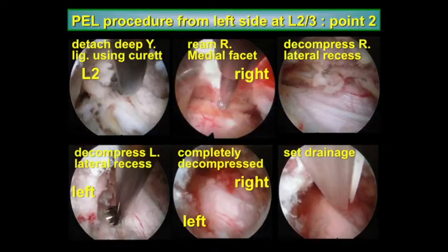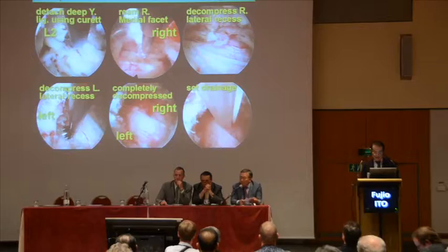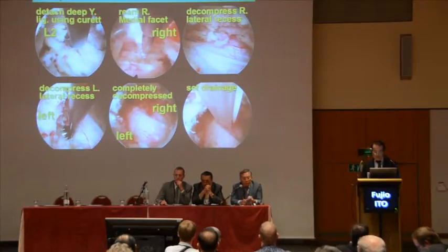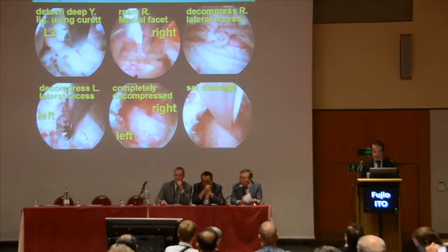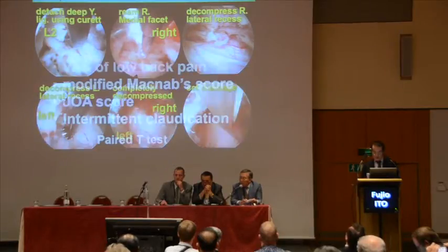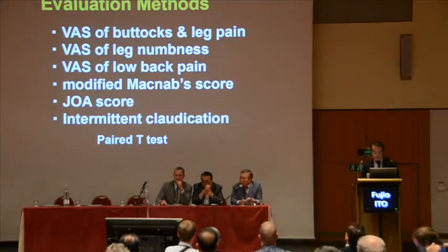Next, on the opposite side, trim the right medial facet. Decompress the lateral recess. Then decompress the left lateral recess. After both sides are decompressed, set the drainage tube in place.